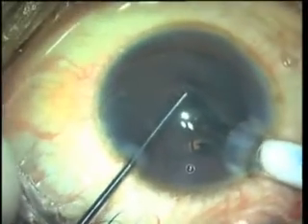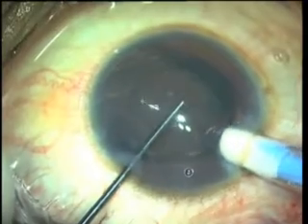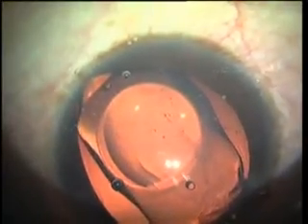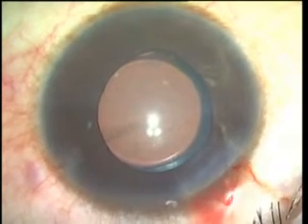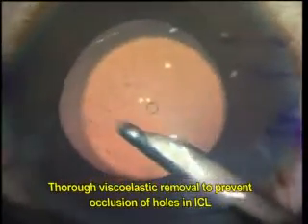Keeping a rod on top of the ICL while unfolding prevents unintentional twisting of the ICL. Slow injection and waiting to have the leading haptics unfolded before further injecting is crucial. Once completely in the anterior chamber, the haptics are gently flexed under the iris. Viscoelastic is removed. Intraocular miochol is injected to constrict the pupil. A peripheral iridectomy is not required with the newer model V5 or Centraflow model.